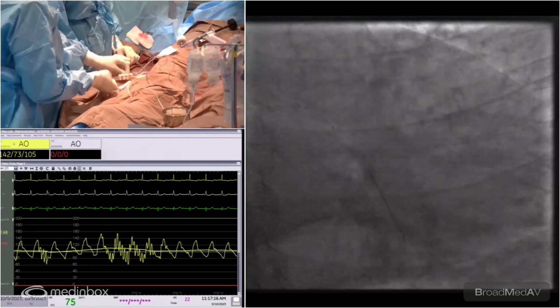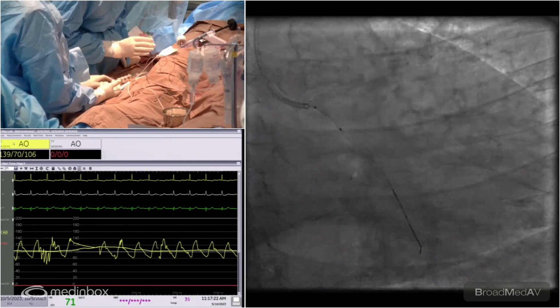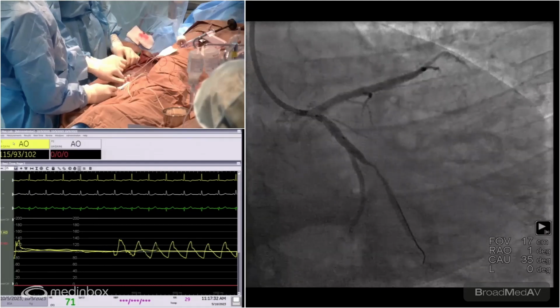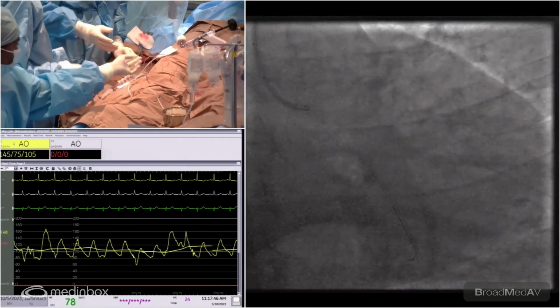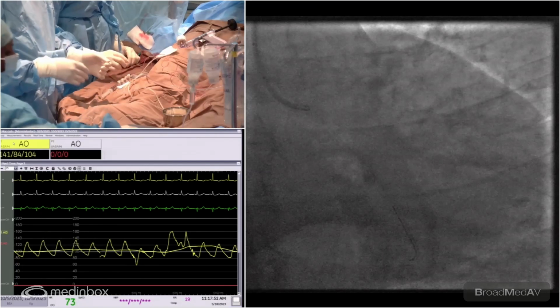Take a small shot, please. Yeah, it's fine. Come, okay. Plain. Small shot. Okay. Inject, please. So it doesn't seem to be the tight part of the lesion. It seems to be some point where the balloon is hitting. Yeah, maybe. So we'll take another wire, a buddy wire, and see what happens. Yeah, it's another BMW wire, please. We play the last shot.